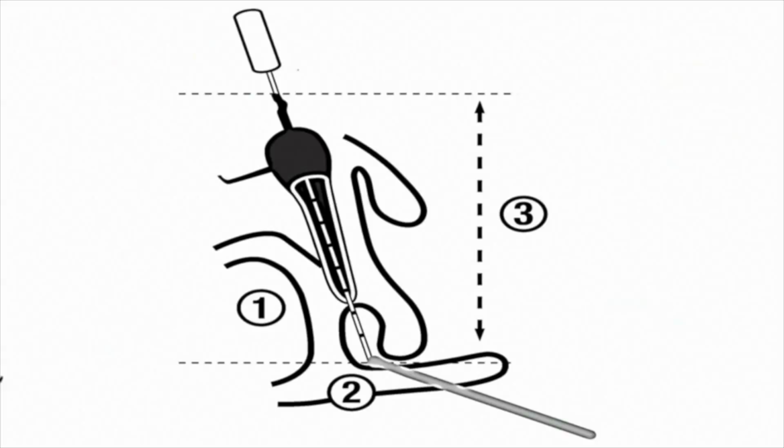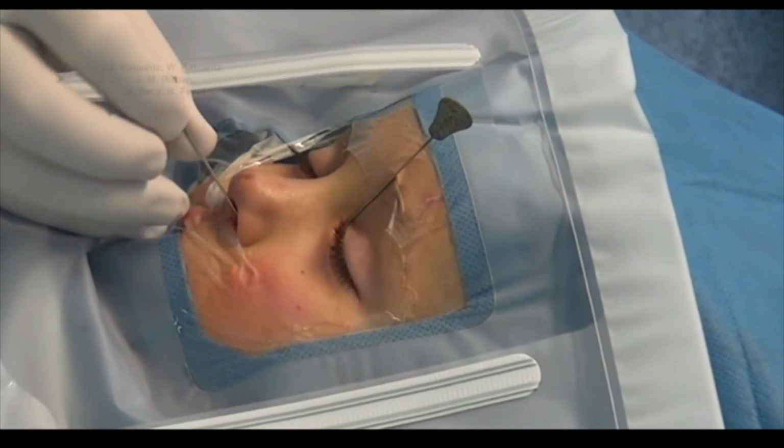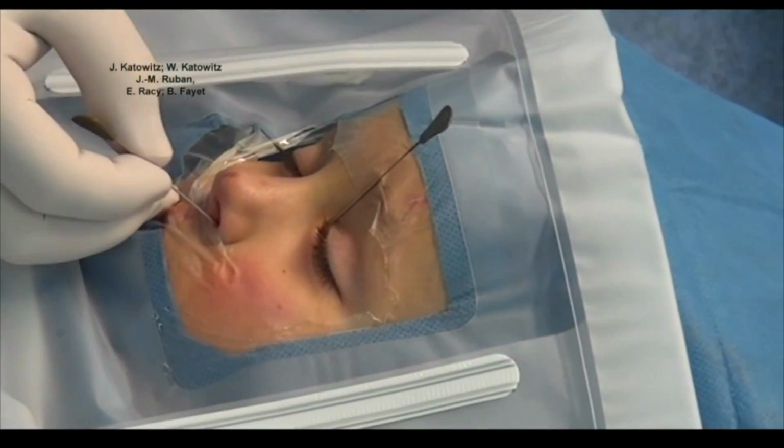Second, is there confirmation that the probe or measuring device has passed through the valve of Hasner and has not created a bony or submucosal false passage? To answer this question without carrying out nasal endoscopy, it is essential to confirm the proper location of the probe with metal-to-metal contact. Positive metallic contact confirms that the measuring probe is in the inferior nasal meatus. The second wider probe should be able to pass freely on both sides of the first probe and be able to cause visible movement of that probe.